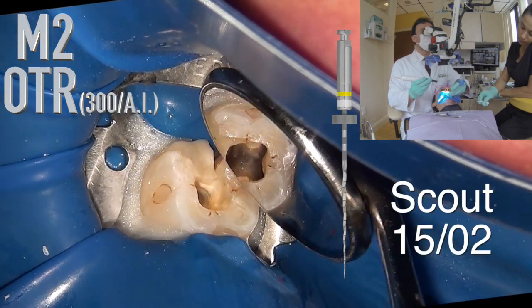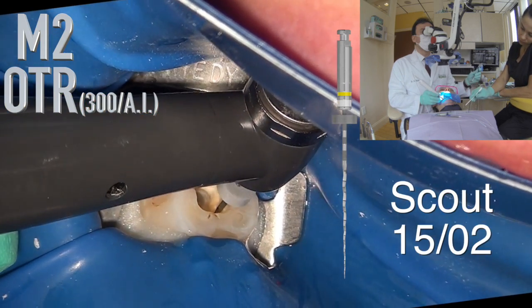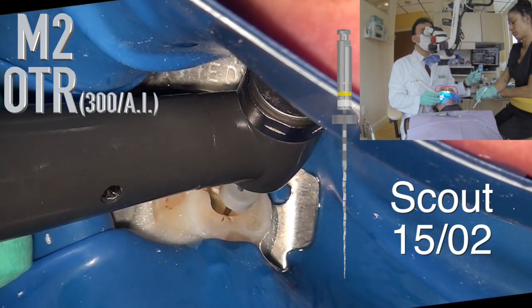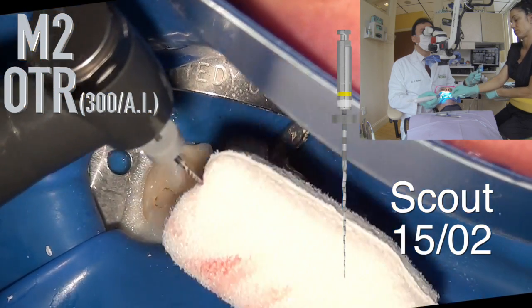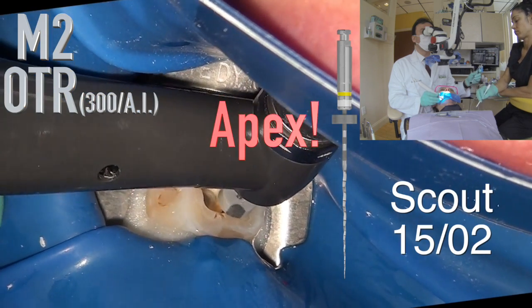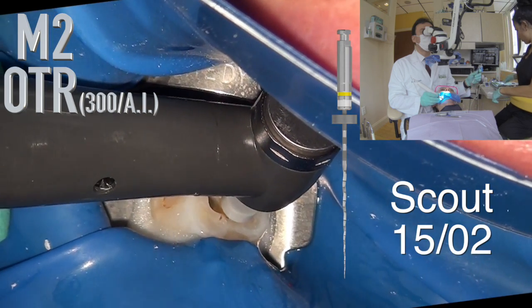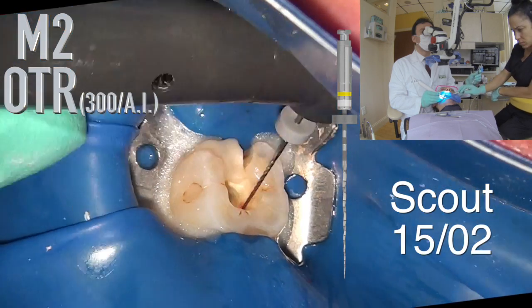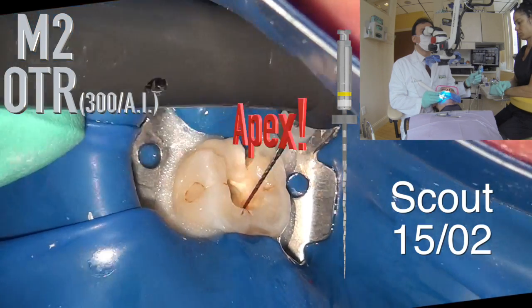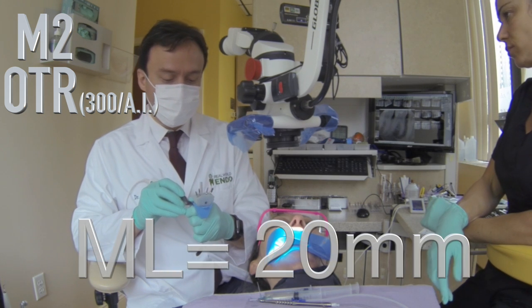We've done the 1505 and the 1504 — it's time for the 1502. As I mentioned, most of the time the 1502 at this point will actually reach the apex. With the Memory 2 setting on the Endosync, it means the handpiece will stop when it reaches the apex. Here you can see we reach the apex and the file just stops. We're basically moving the stopper to the reference point and then measuring to see what length we have.